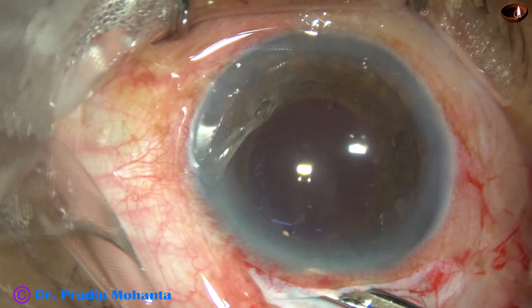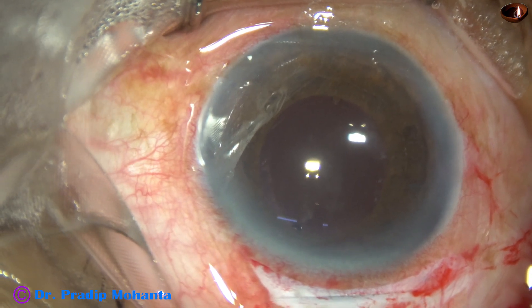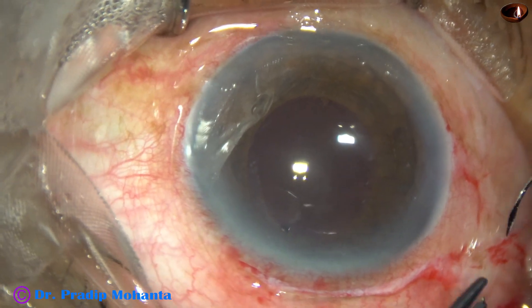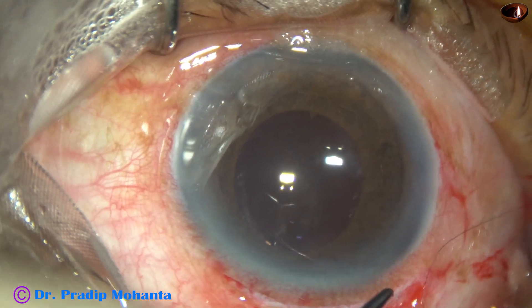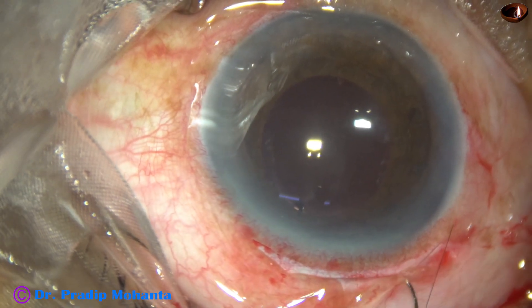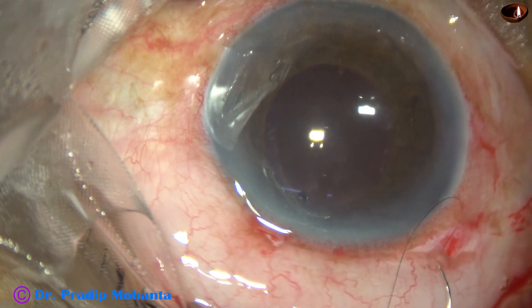This is another lavage of the anterior chamber. The anterior chamber is nicely formed. We check the integrity of the wound — there is no leakage. Now I place a releasable suture at the right end of the peritomy where I took a radial cut.